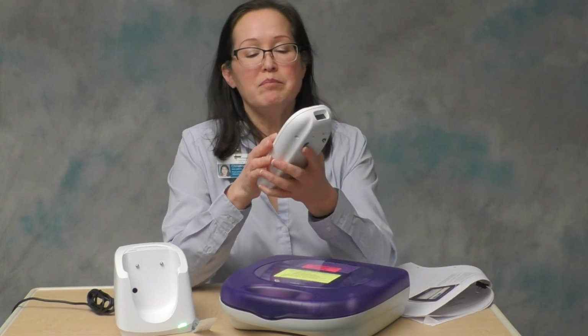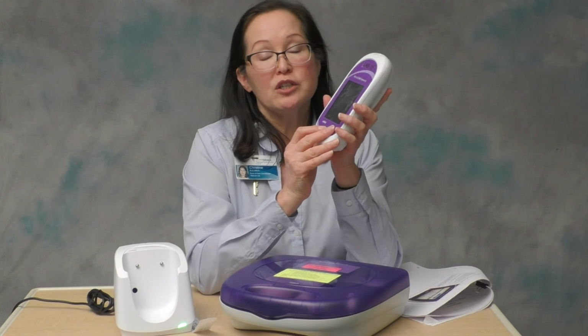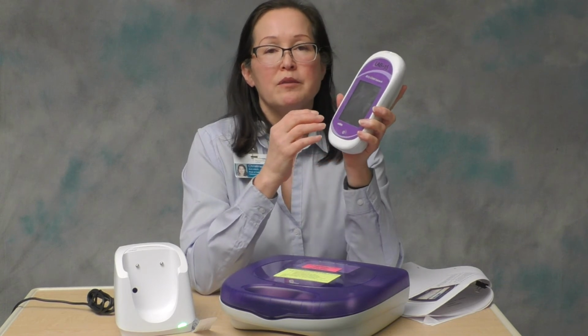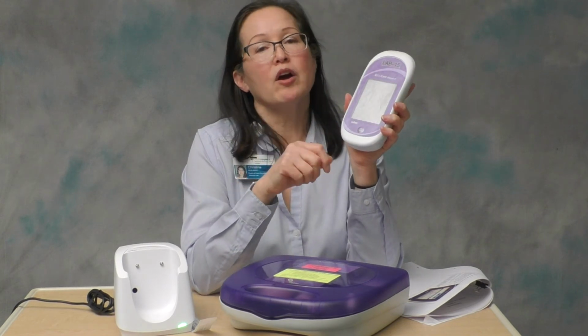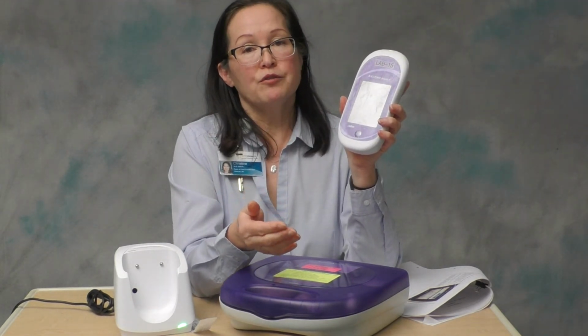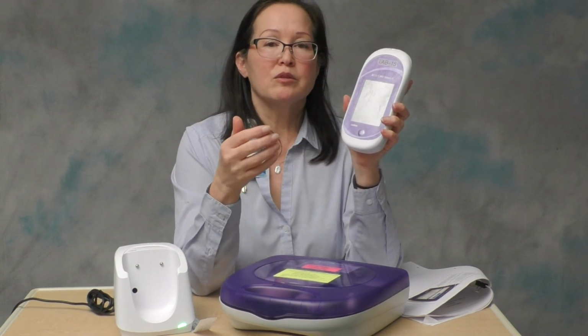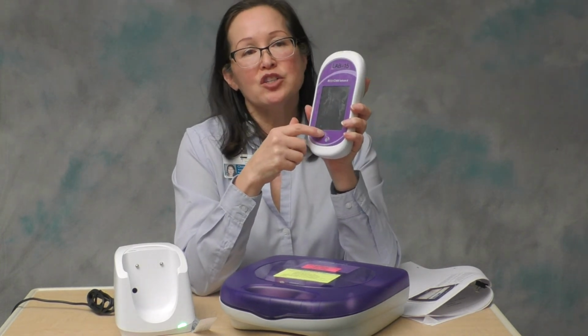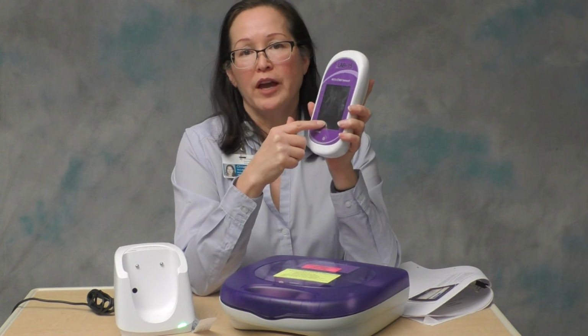Now you may get a message that says the patient is not found and it just displays the CSN number. This occurs when the patient's registration process hasn't quite caught up to where their location is in Epic. So say for example you have a patient that's been in X-ray. They actually get a different CSN number assigned for their X-ray encounter. And so if Epic hasn't registered their change when they come back to the floor yet, when you scan the badge, it may show you that the patient is not found.